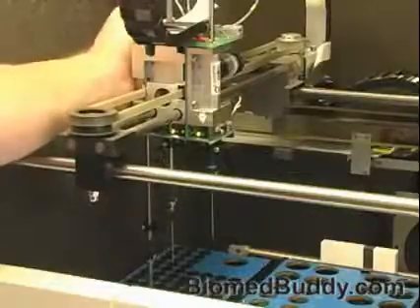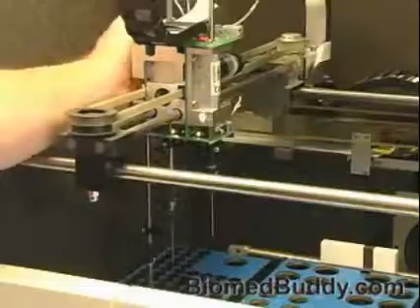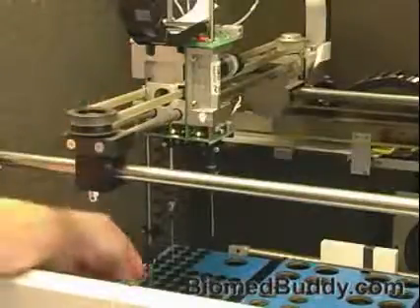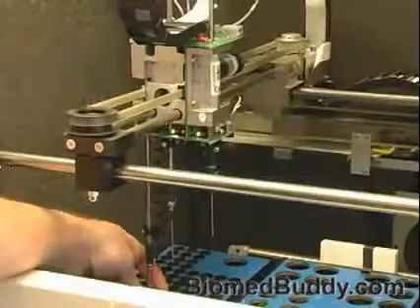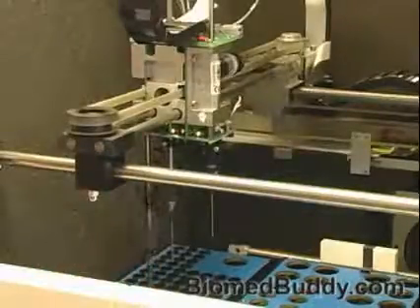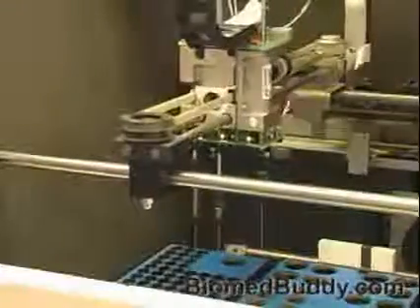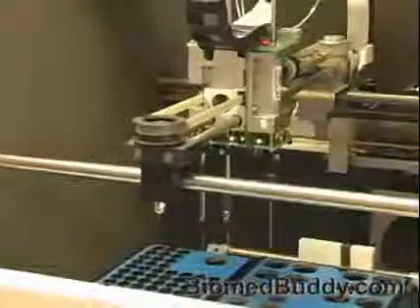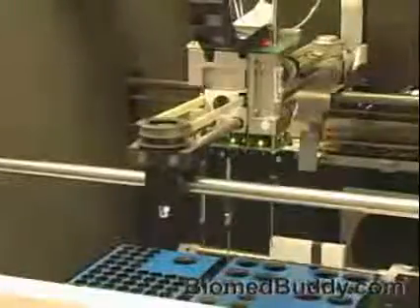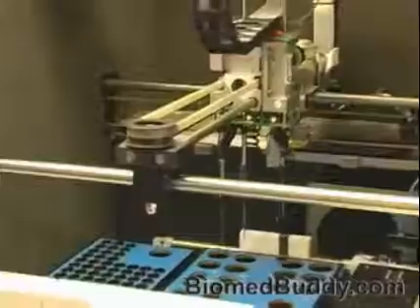Now the unit's going to subtract a little and do some mathematical things so that it doesn't hit the bottom. It'll never go to the bottom. But for your purposes, you want to go to the bottom. And you can see I'm in the bottom. Now I'm going to hit F10 to lock it in. Again. And it's locked in. Now it's going to go to the home position, and it's going to go to the wash wells.